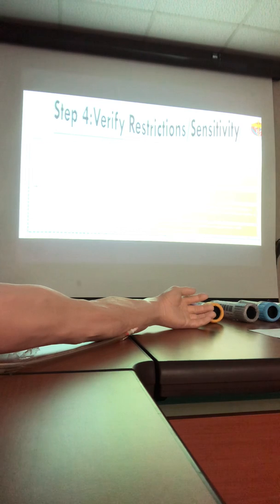12 to 16 hours. The patient may have water, or we should ask. According to the new system, I think they changed it for cholesterol. If there is only cholesterol, the patient has no need to fast. If it's only cholesterol and high density lipoprotein, no need to fast. But if there is an order for lipid profile, the patient should be fasting for 12 to 16 hours. Okay.